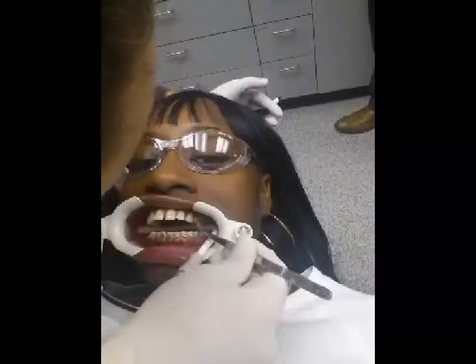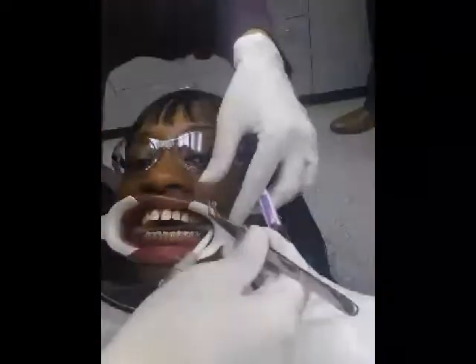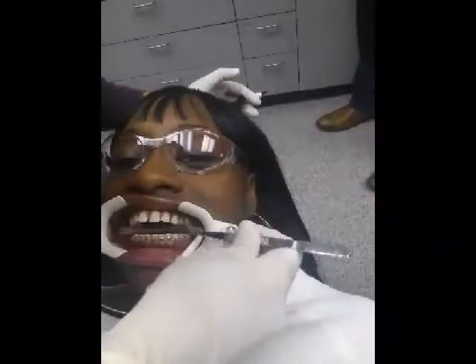And there's my orthodontist again, well, his shoes at least. And he's just pretty much watching and waiting for her to be finished so he can come behind and check the placement and make sure that they're in the area of the tooth that he wants it to be.